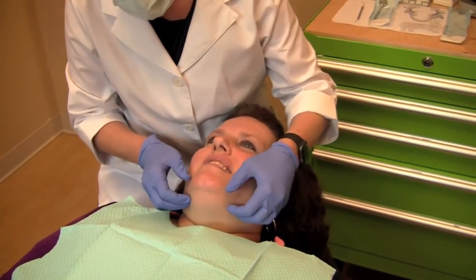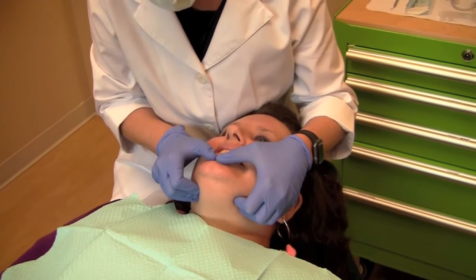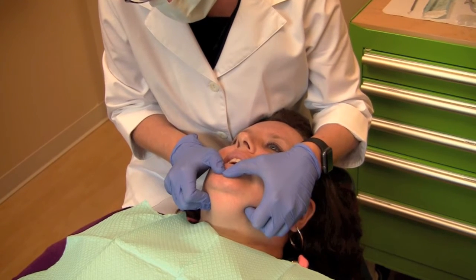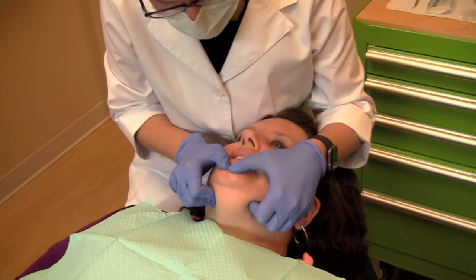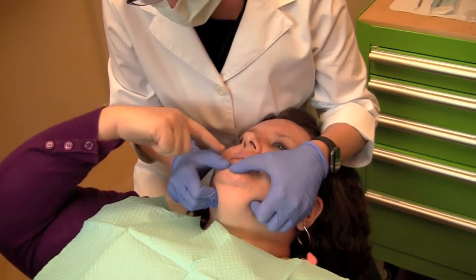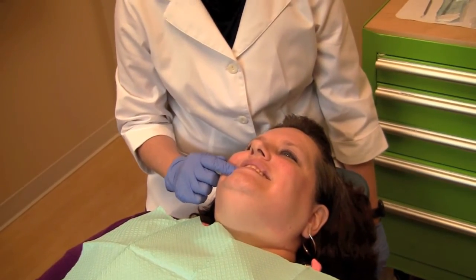So go ahead and put your chin up for a second. Separate those teeth. Let everything hang nice and loose. Tension, tenderness, tension or tenderness, tension or tenderness. Go ahead and lightly close till your teeth first touch. And point for me. Correct. There we have our first point of contact.